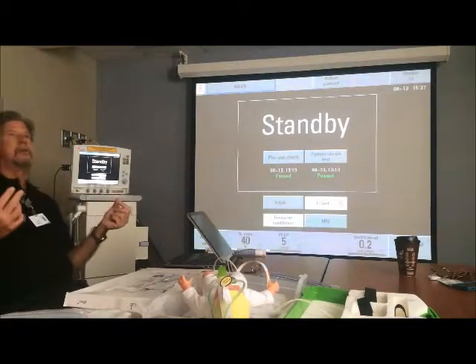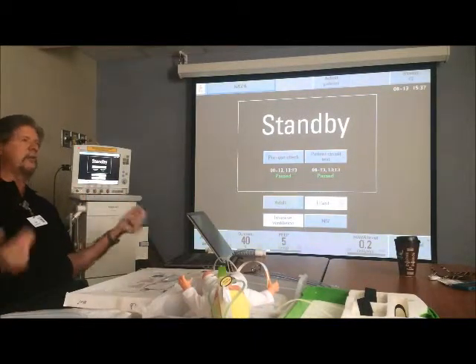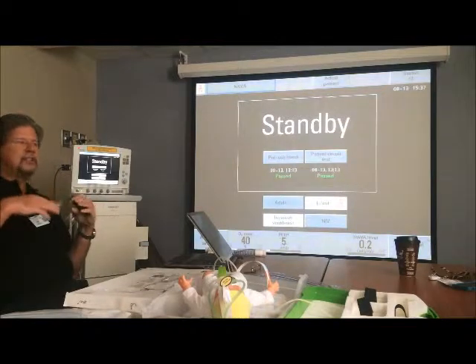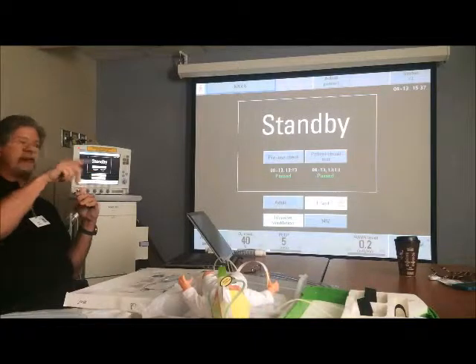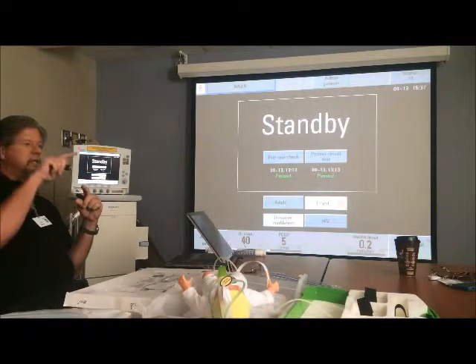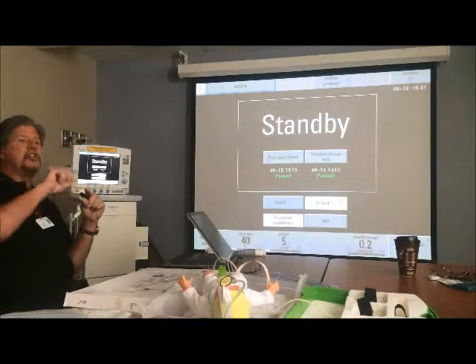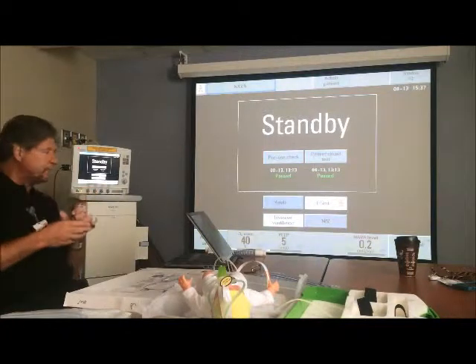And then his brain goes, oh, okay, I'm getting the volume, good. And the CO2's coming back in line. I don't have to tell the diaphragm to contract as hard because I'm getting the volume. The diaphragm begins to recover. The EDI goes from 100 down to 80 or 70, right? I mean, very quickly, because 0.2 times 70 now is 14. 14 centimeters of support is producing the same tidal volume as it took when his EDI was 100 because his diaphragm was so fatigued. Right?